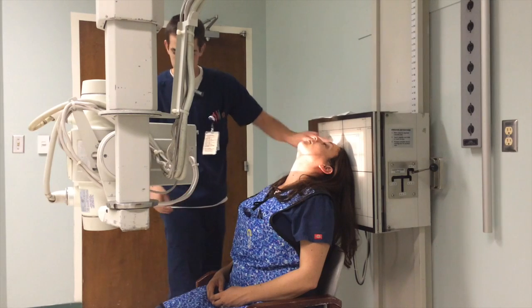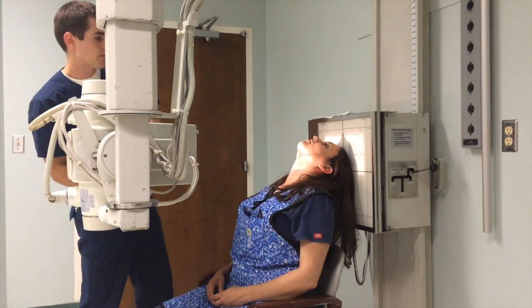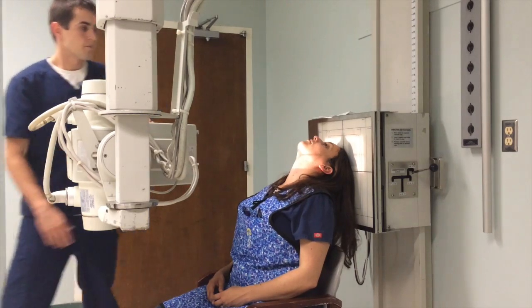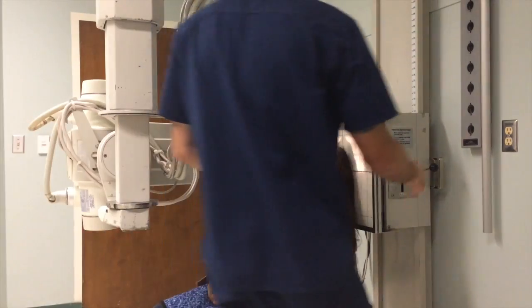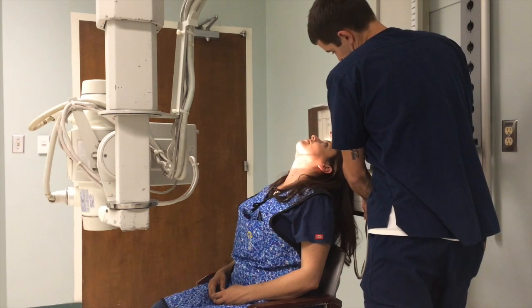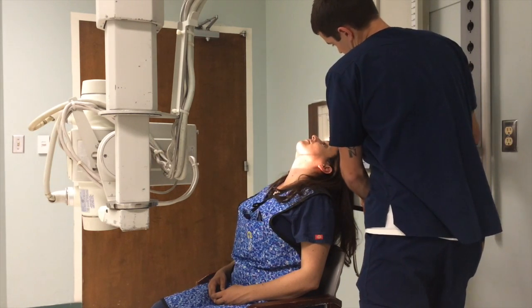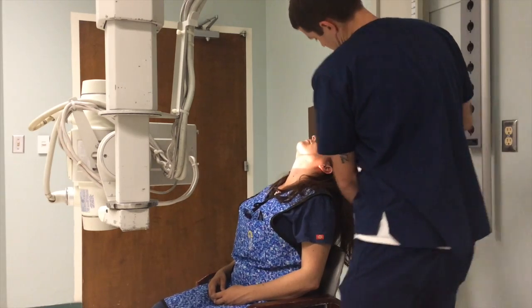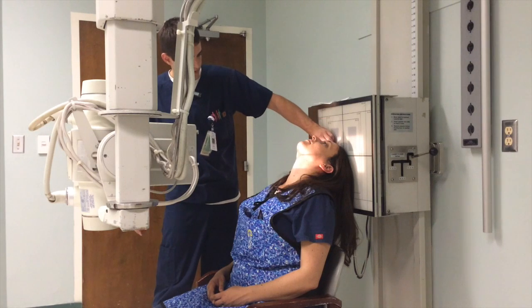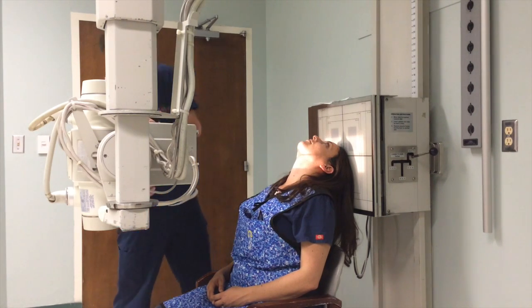Get our right marker on there still. We're going to come down. Raise the IR just a little bit. So it's lined up. Right. View.